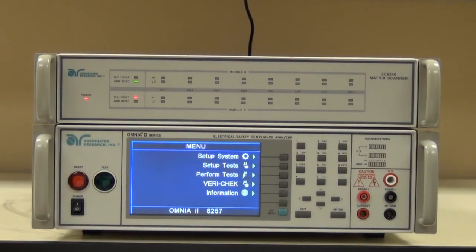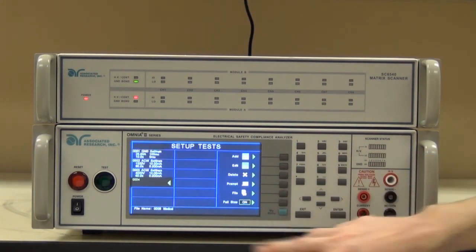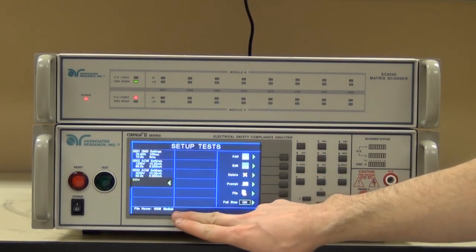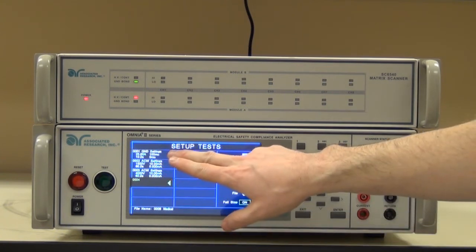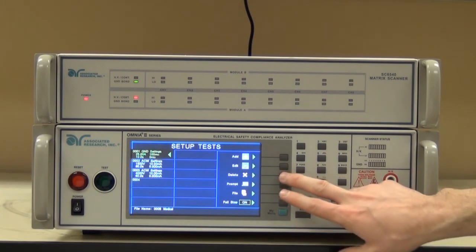For this application, a customer needs to run a full series of safety tests. The customer will be running the sequence to test their product to the IEC/UL 60601-1 third edition standard for medical devices. For this example, the end user needs to run the test sequence outlined on the unit. I've already pre-programmed in a file named "medical." As you can see, I've added a ground bond and two high pot tests. I'd like to briefly cover those two tests.